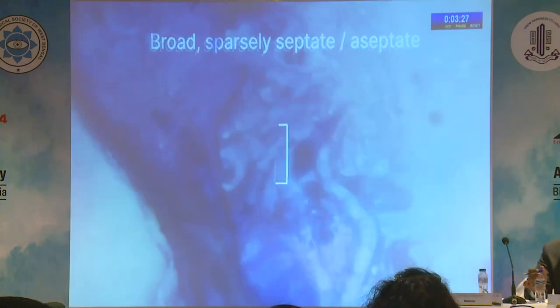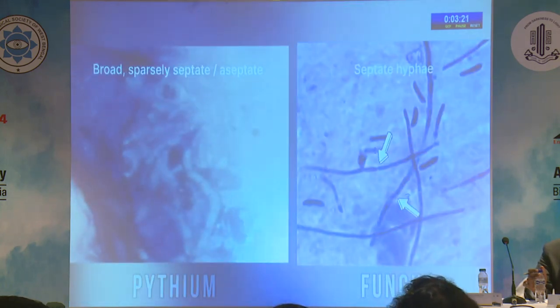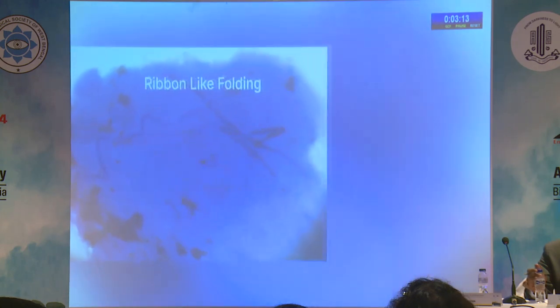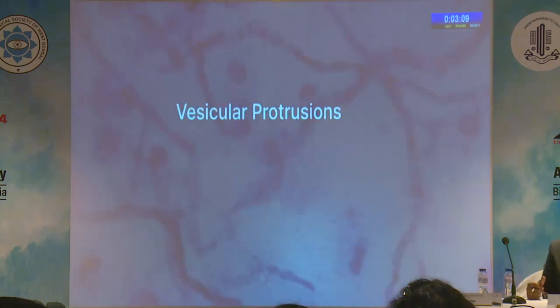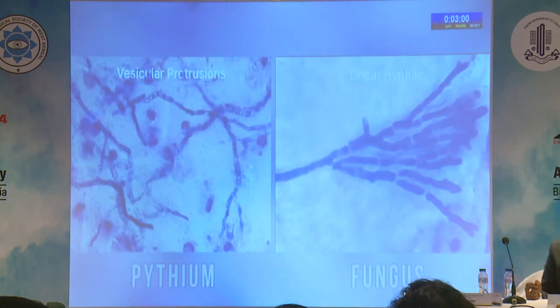Pythium filaments are broad and sparsely septate or aseptate compared to septate hyphae of fungi. They have a typical ribbon-like folding with truncation at certain points, as shown by the arrow, in contrast to linear hyphae in fungi. The intrahyphal vesicles or vesicular protrusions are depicted by the arrows, which are absent in fungal hyphae.